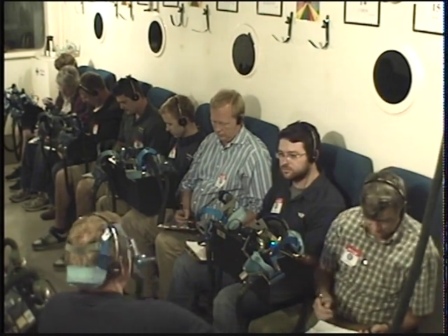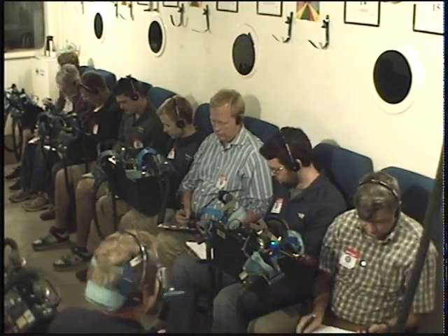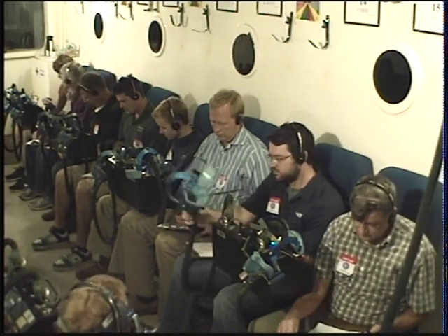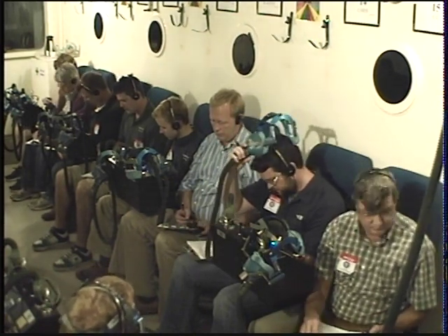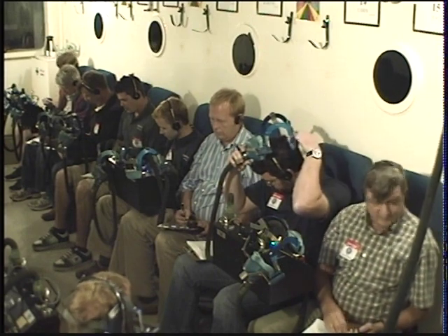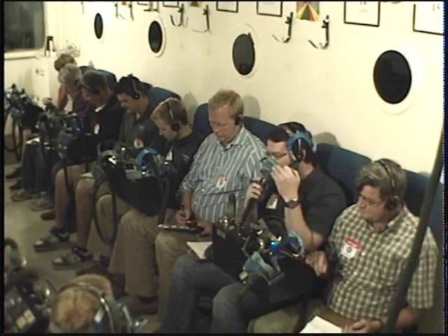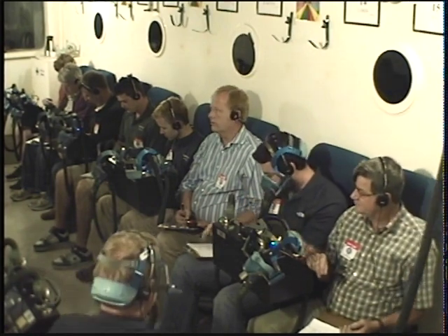All right. Our objective today actually is 3 symptoms. So once you get 3 good symptoms, you should really think about putting that mask on and correcting for the situation. The rest of us, if you have your mask off, should go ahead. We'll wait just a second here, and we'll go to the 3-minute column in about 10 seconds.